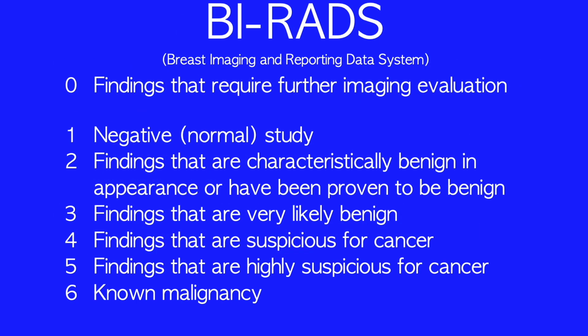Moreover, radiology reports on all breast imaging studies, whether mammography, ultrasonography, MRI, or scintigraphy, must include the radiologist's assignment of a Breast Imaging and Reporting Data System score, that is, BI-RADS rating. BI-RADS 0 is a commitment to the importance of having the patient return for further imaging, such as magnification mammography views or ultrasonography, before an imaging diagnosis can be made.